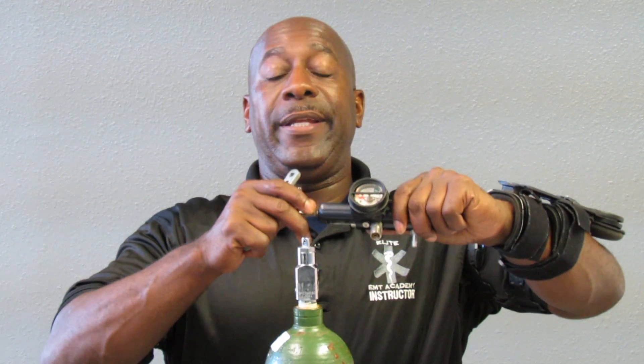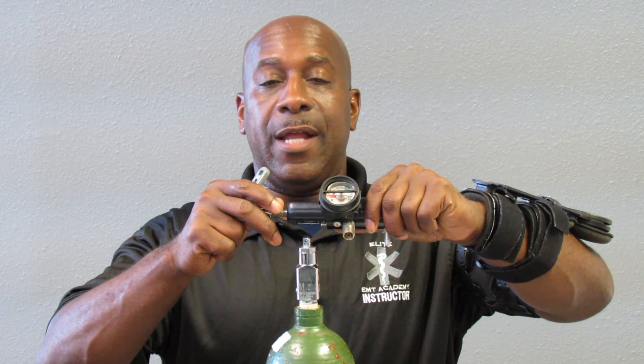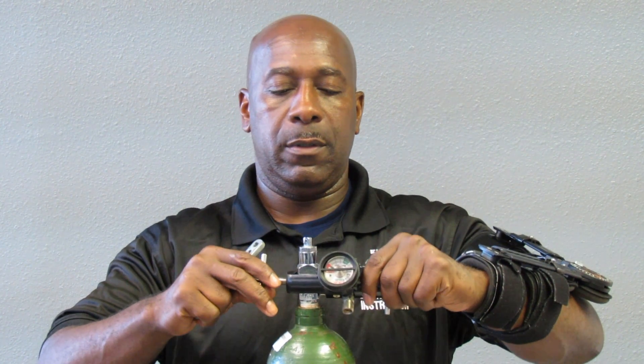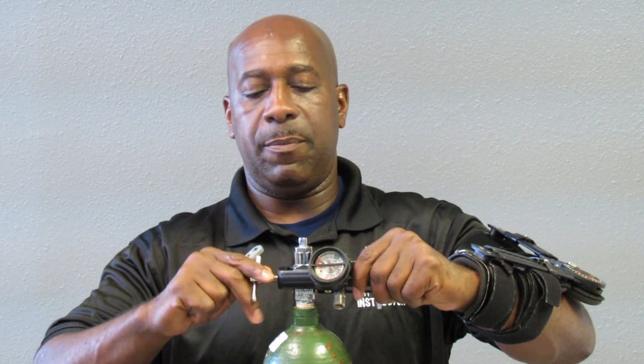To appropriately attach the regulator to the oxygen bottle, you want to slide your regulator over the pinholes, place it appropriately, and then screw it down to tighten it.